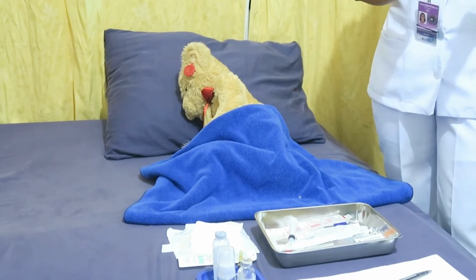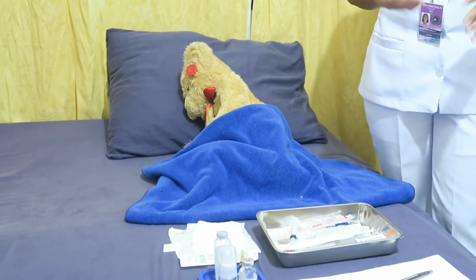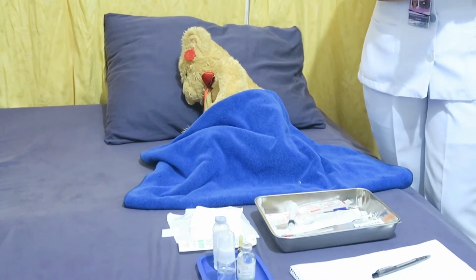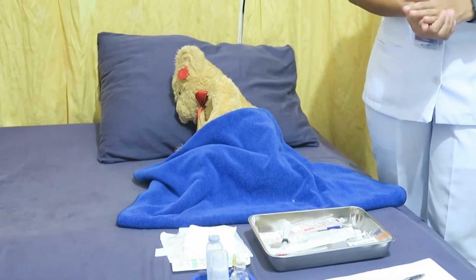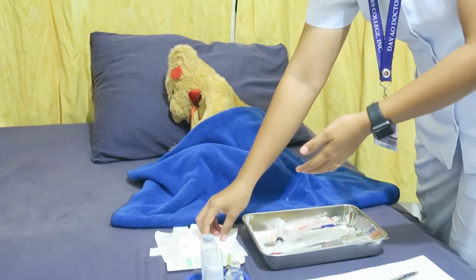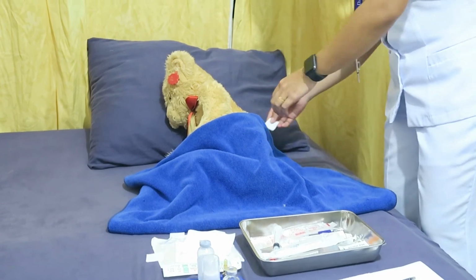So, after that, apply clean gloves. Let's assume that we already wear the gloves. So, the next is to clean the site with an antiseptic swab using a circular motion. So, let's clean the site.